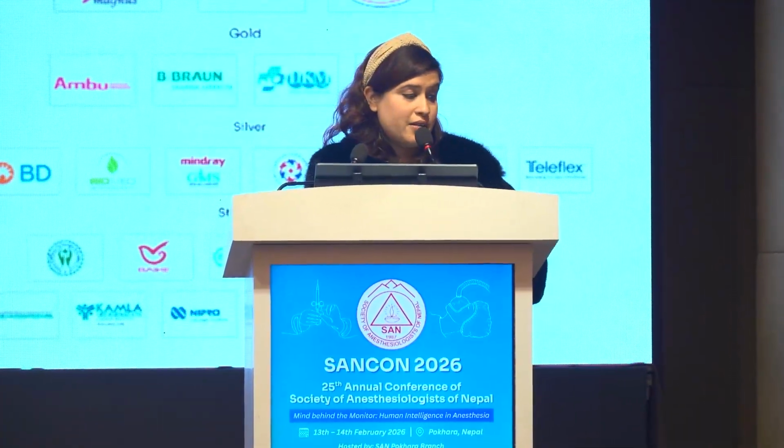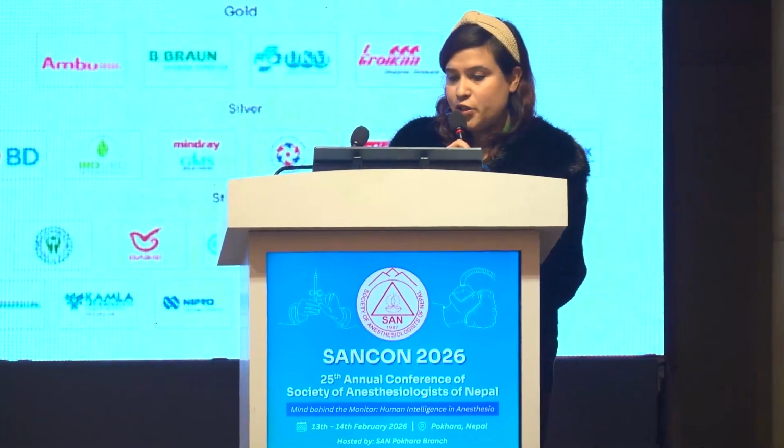Thank you, sir. So unlike Dr. Abhi, I don't have my rebuttal pre-prepared. There are a few things that I'd like to highlight that she recently mentioned. First is regarding thrombosis risk. I believe the studies say that thrombosis risk is not device dependent alone. It depends upon patient selection, the technique of the cannulation, and the catheter-vein ratio. Modern evidence shows that when the catheter to vein ratio is less than 45%, measured under ultrasound guidance, and when proper tip confirmation is done while inserting a PICC line using a C-arm or an X-ray, thrombosis risk in fact drops significantly.